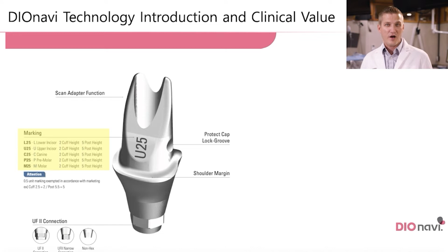I appreciate the thoughtfulness with soft tissue. Soft tissue, we know that if we can put an abutment in early and leave it undisrupted, then with that, we will have a long-term soft tissue connection around these titanium surfaces. And so I love the idea of an anatomical abutment going in the day of surgery, staying in because it does not need to be removed for impression taking, and then being our final abutment if that's what you choose. It's a really clever abutment. It's a little more economical. It's very thoughtful to soft tissue. I think it's a very, very clever idea.